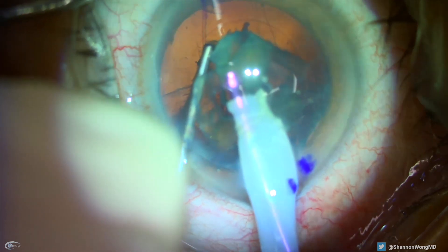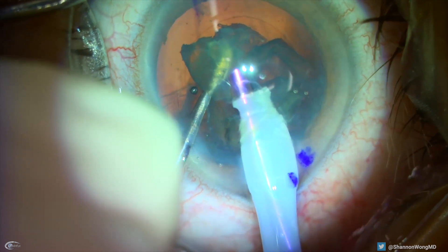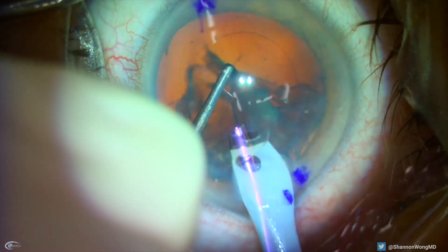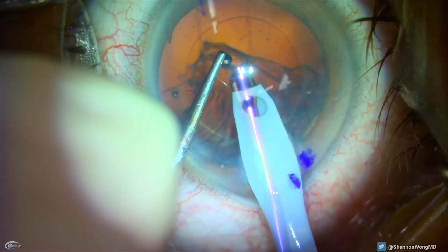Now we have to prioritize and execute and remove the nucleus from the eye without letting pieces of the cataract fall into the vitreous. So I place my chopper below the nuclear fragment and in front of the posterior capsule to prevent the nuclear fragments from going south.